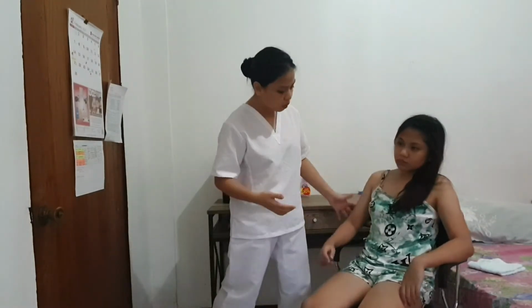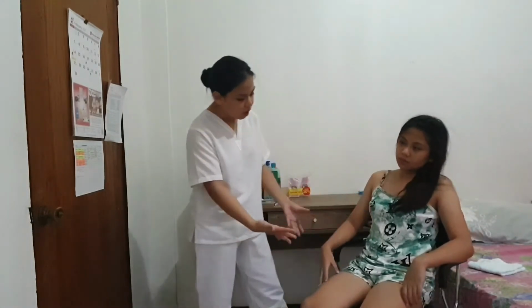As you can see, my patient is not wearing a lab gown or clothing that has sleeves. She is only wearing a tank top. So later, I will just ask her to raise her arm. Also, she's already in a sitting position, because it will be easier for me to place the thermometer under her arm. Okay, ma'am, please raise your arm.